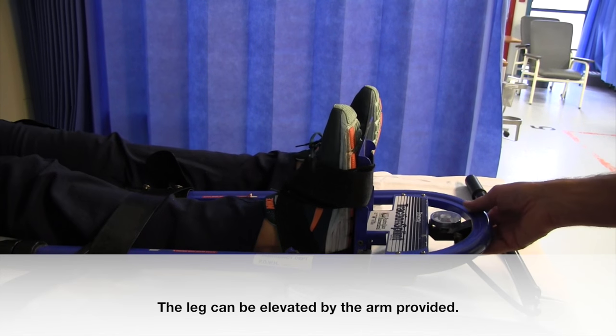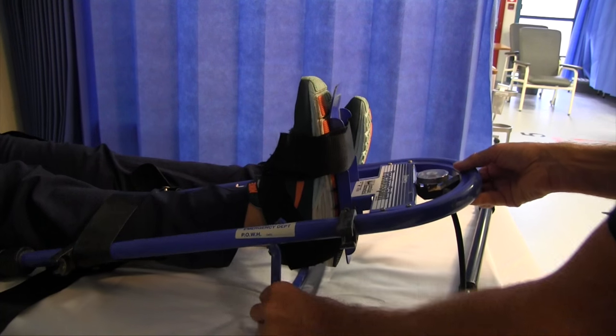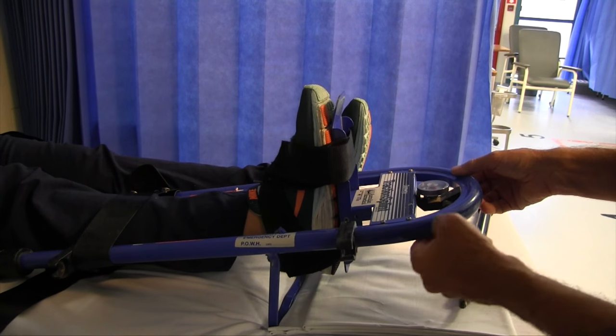The leg can be elevated by the arm provided.